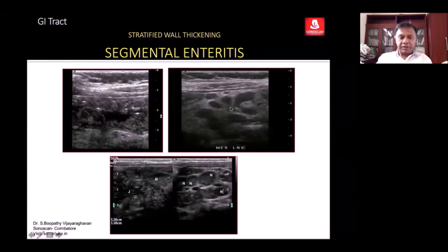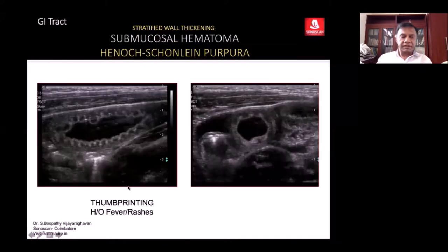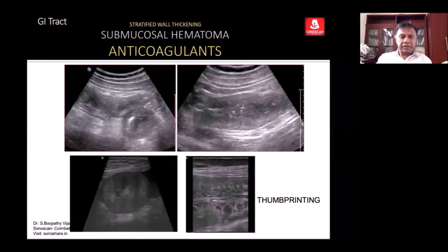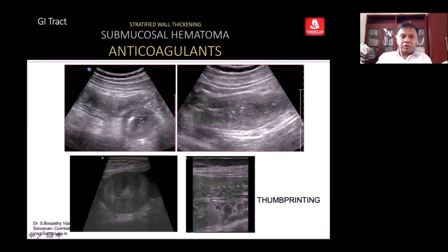A long segment thickened bowel retaining the layering of the bowel wall, with a few enlarged mesenteric lymph nodes, can indicate recent onset acute abdominal pain. When you do the scan, you see a loop of bowel that is thick-walled but still stratified — the layers are preserved. In a patient who had open heart surgery on anticoagulants presenting with acute abdominal pain and distension, you see a thick-walled loop of bowel in long axis.